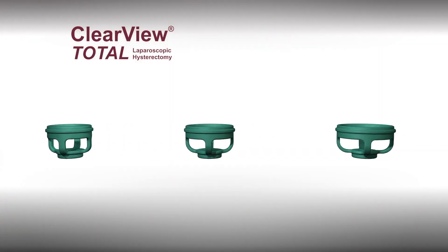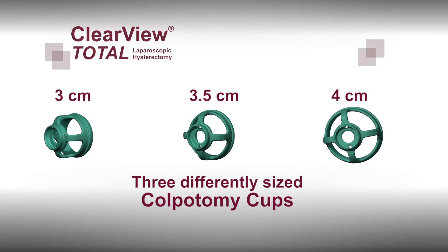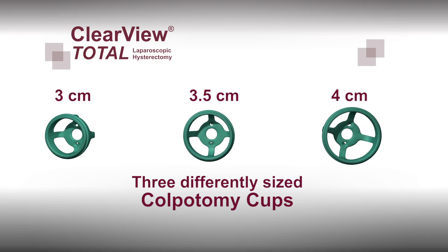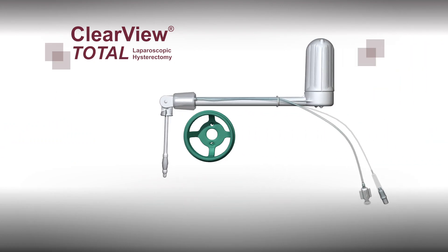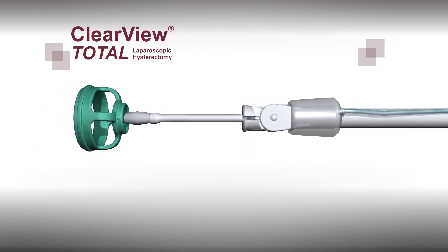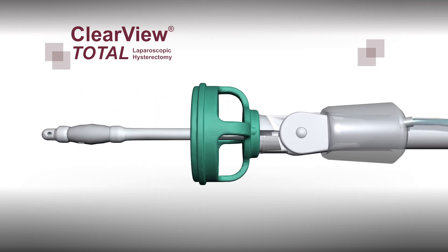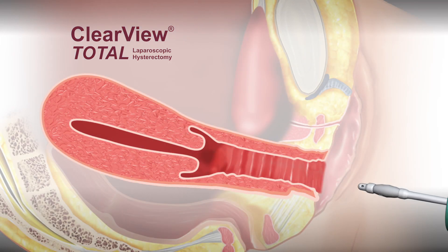Each Clearview Total kit comes with three different sizes of colpotomy cups to ensure the proper size is available. The colpotomy cups were designed with openings to provide optimum visibility during insertion. They are made from a proprietary material which, unlike many other colpotomy cups, can be used with both electrosurgical and harmonic scalpels. Once the correct size is selected and snapped tightly into place, the device can be carefully inserted into the uterine cavity.